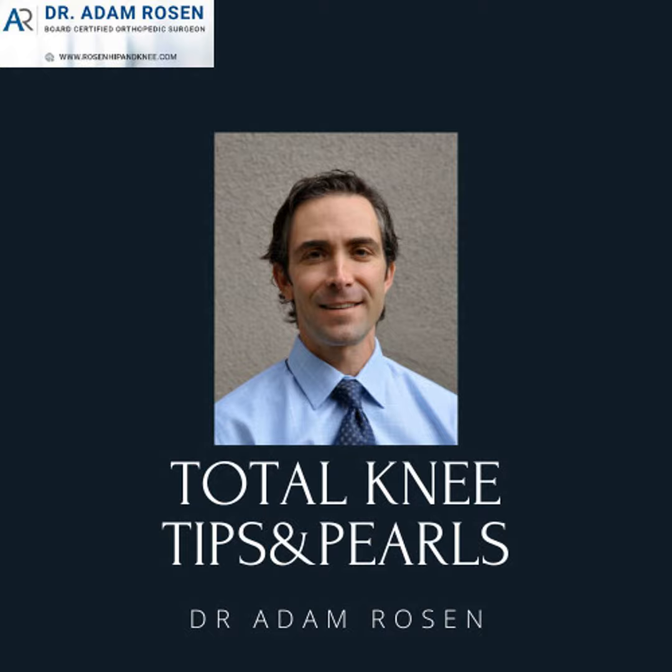So we've gone through describing the views that you have. Are they skeletally immature? Are there soft tissue changes? And then for the knee specifically, we're looking at neutral alignment, varus alignment, valgus alignment, referring to the joint spaces, and it's always good to describe where the joint space is narrowed. Is it narrowed medially, laterally, bicompartmentally, femorotibially, patellofemoral? Is there lateral tilt? This is even important for sports stuff too. There may not be arthritis, but is there lateral tilt? Is there lateral subluxation? Is the trochlea dysplastic? All of those little things.